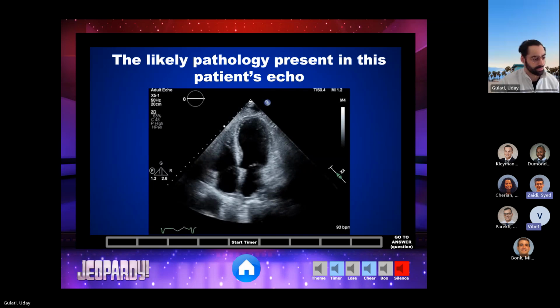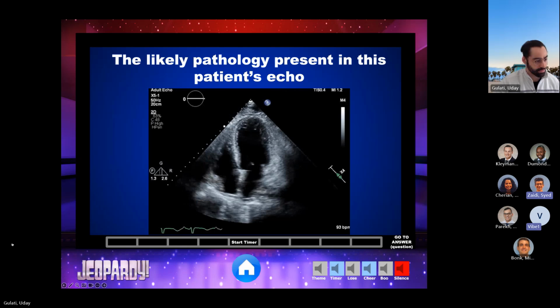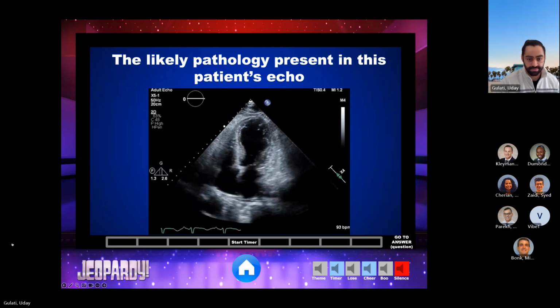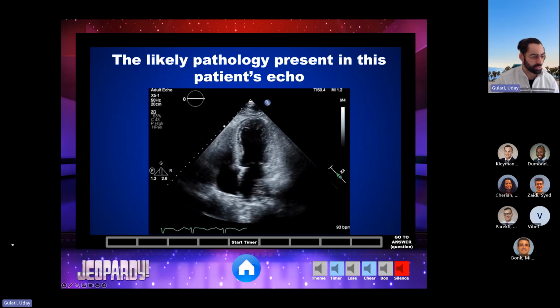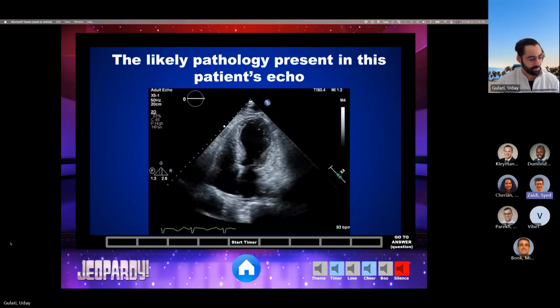So you're not seeing a lot of apical wall motion on the LV. There's good movement of the, I'm just thinking out loud. I wasn't sure if you raised your hand. I saw a hand raised, so I wasn't sure if that was the old one or the new one. It was the old one, but that's fine. So not a lot of apical wall motion. Would this be stress cardiomyopathy or Takotsubo?